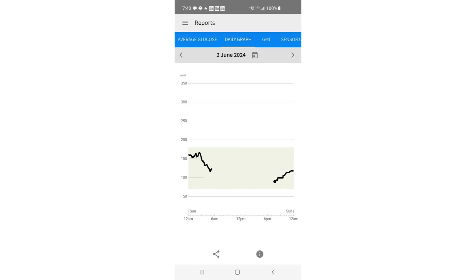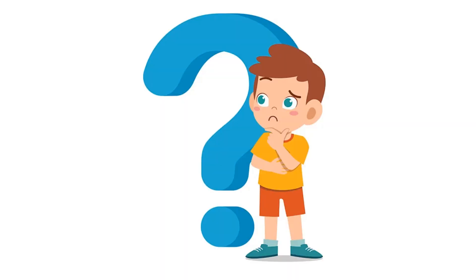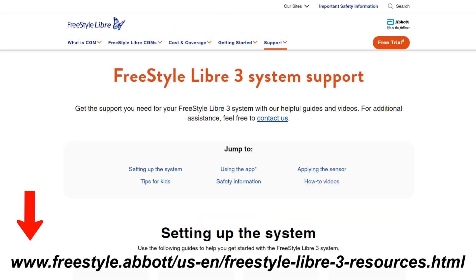Whether it's like this one, where it was just a complete failure of the unit, or the unit comes off completely — I've already done a video on how to more securely attach the Libre 3 sensor, but fall-offs are inevitable. So what do we do in a situation like this? Abbott Laboratories has a very good support department.